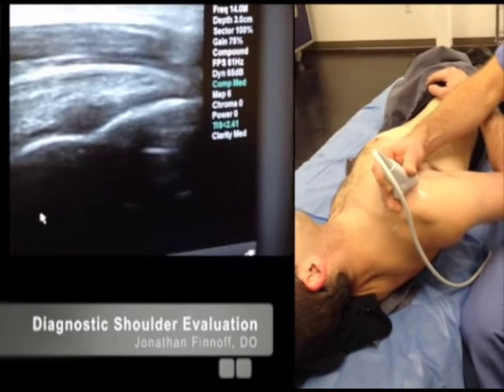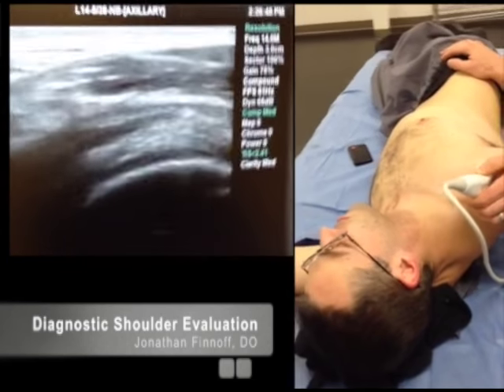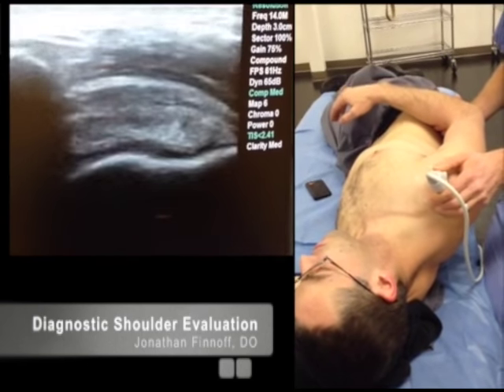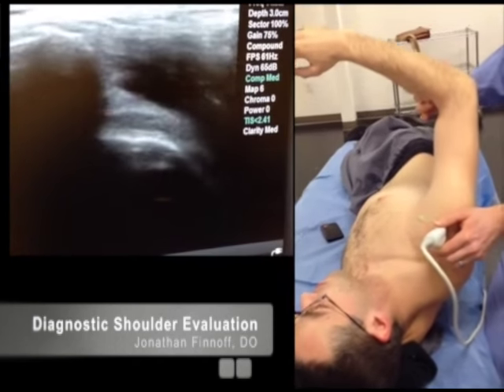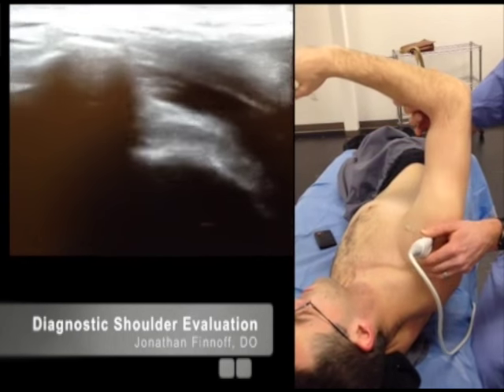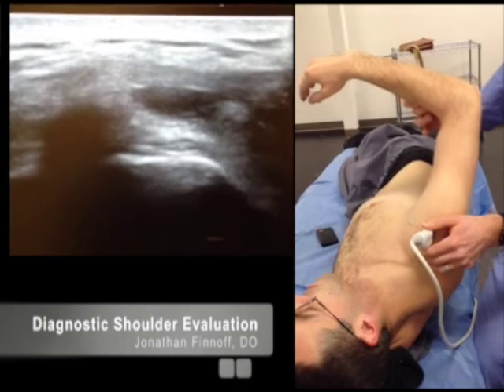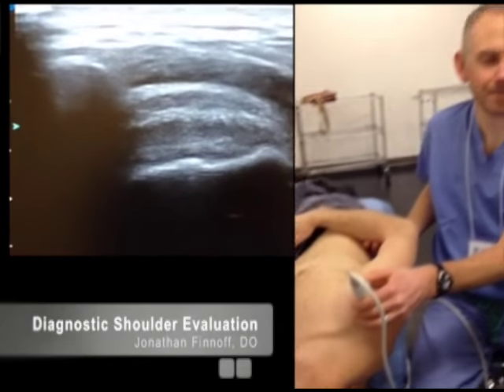You can also do a dynamic evaluation for subacromial impingement. I come far enough medial to get my acromion in the screen along with the supraspinatus, then have the patient lift up their arm. You can watch for the greater tuberosity being buried underneath the acromion, and look for bunching up of bursal tissue or any fluid milked out of the bursa during abduction. All right — that's the whole shoulder examination. Thank you.